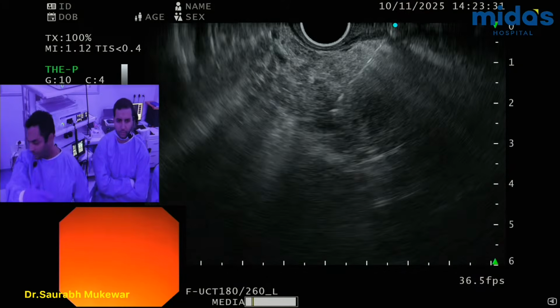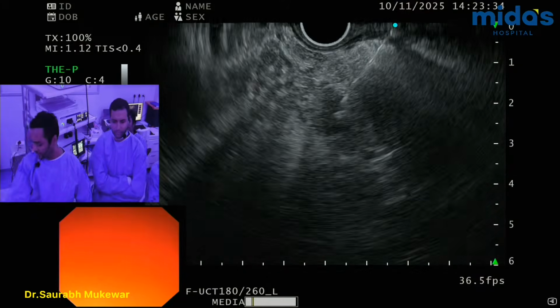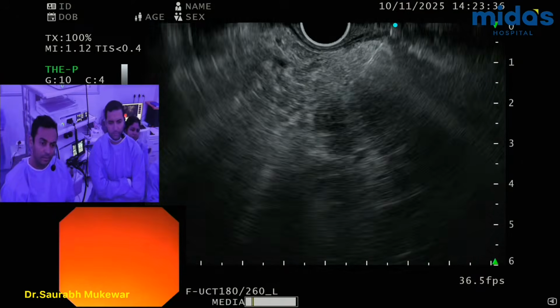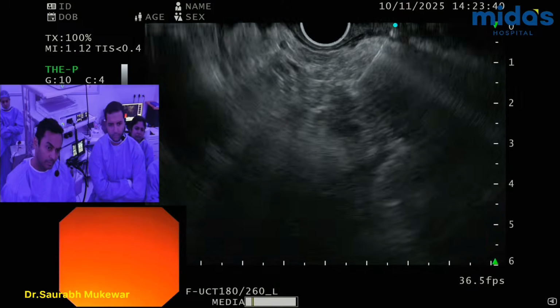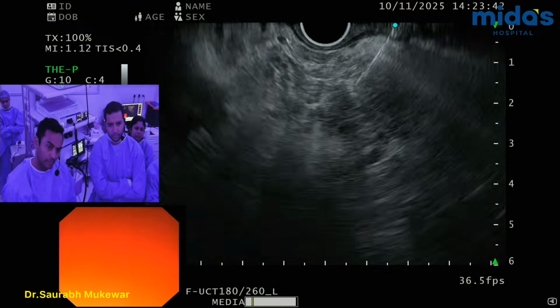You see how much space I have, how difficult it is to get in. Alright, okay.